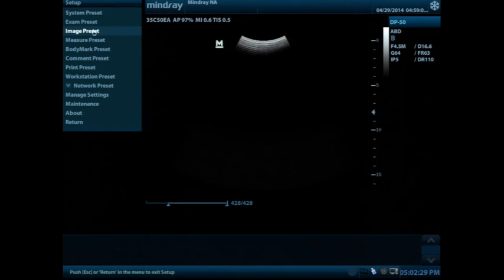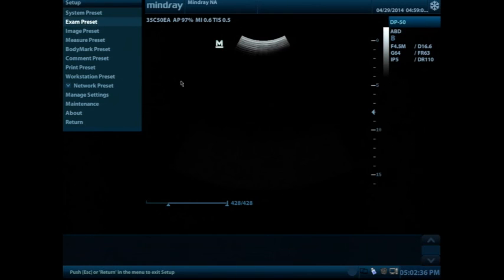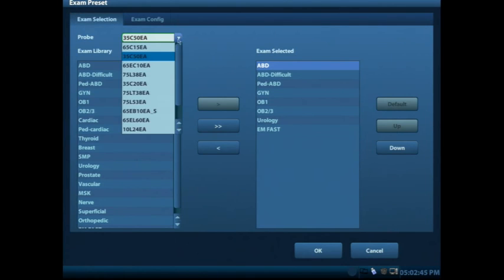As you look at other things that are on this list, you see exam preset, image preset, as well as a few other things. I'm going to briefly talk about exam preset. That shows you what is loaded on each transducer. You can see that one of the transducers plugged in is my curved transducer.